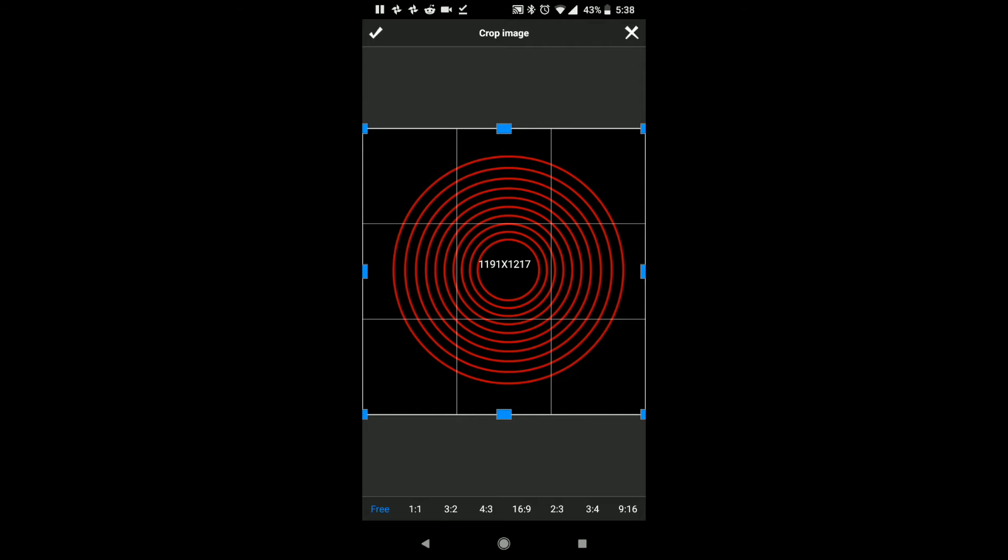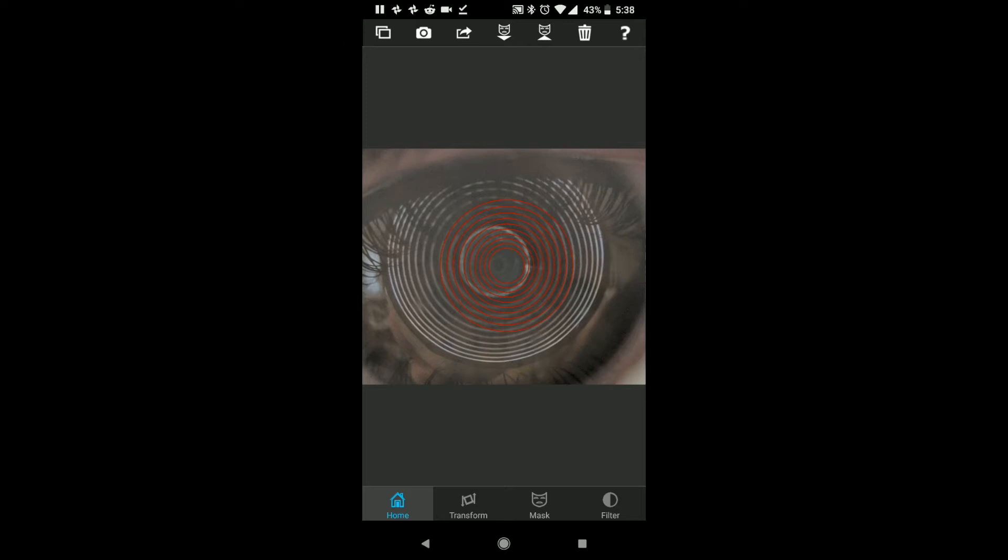And we don't have to crop that. I'm going to say yes, and this is rings.png. Now, here's the trick. I'm going to click on transform at the bottom, okay?